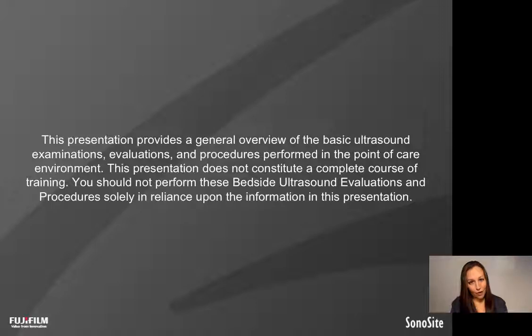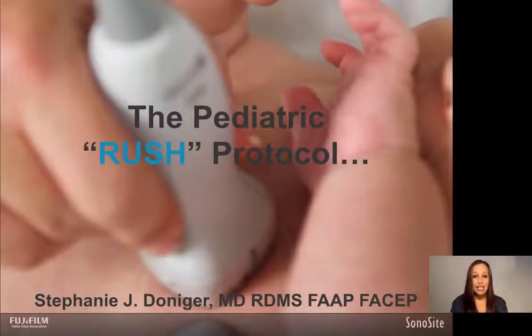My name is Stephanie Doniger, and I'm a pediatric emergency medicine physician. I will be speaking with you today about one of my favorite topics, the pediatric RUSH protocol.